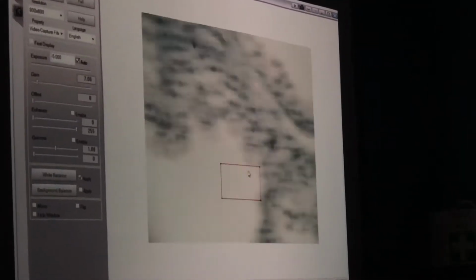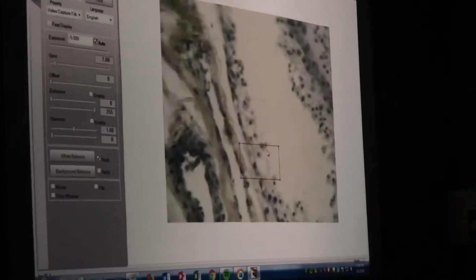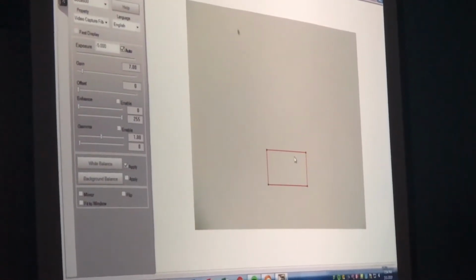All right, anything else we need to know about the testes? We're going to call all those cells sperm cells. We'll call them spermatogenic cells. I would say spermatogenic.